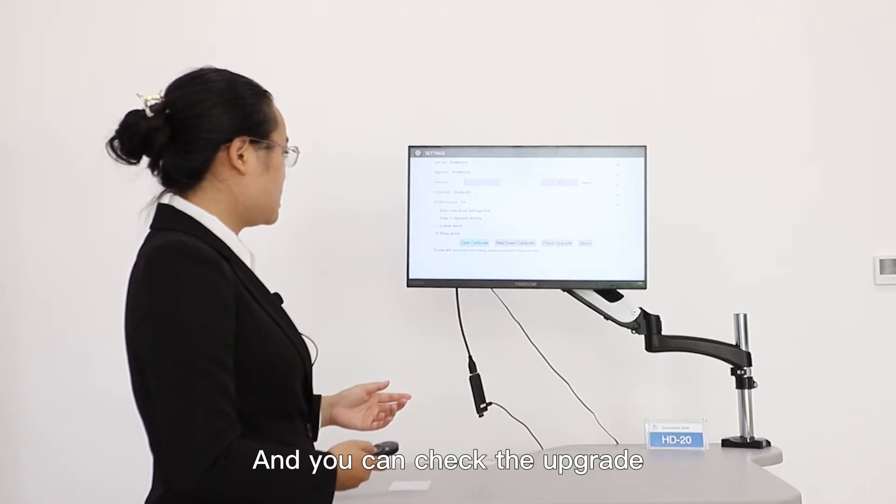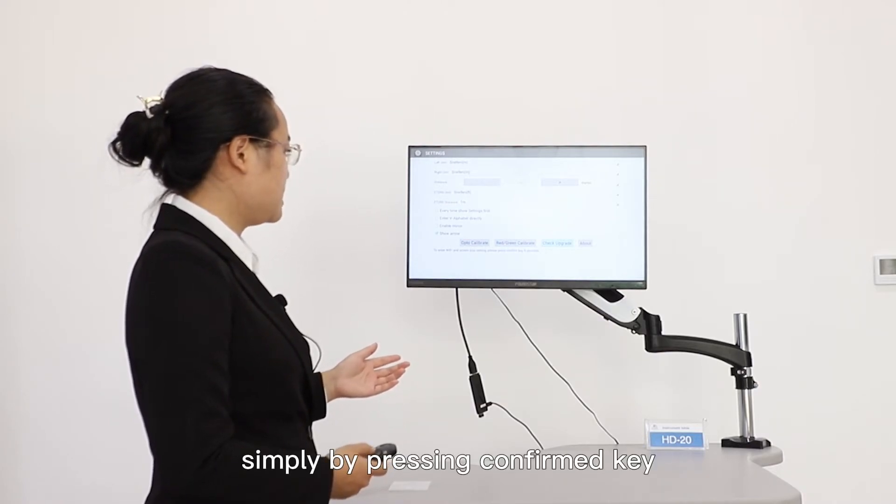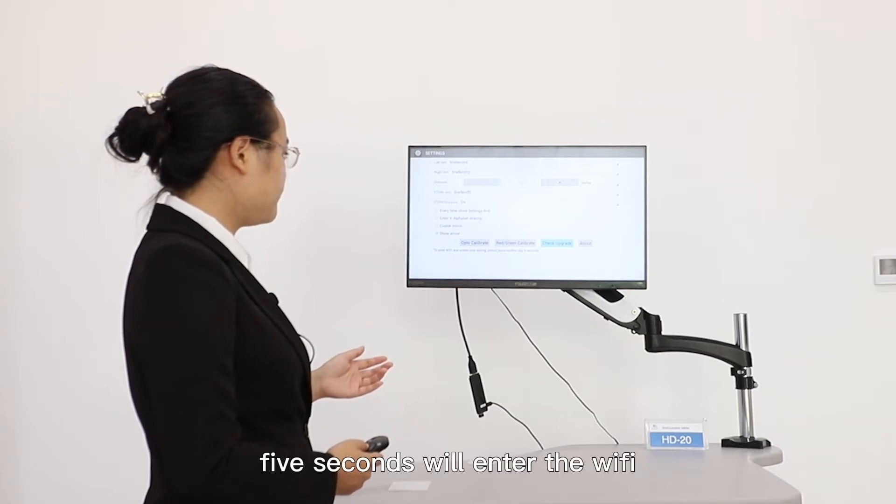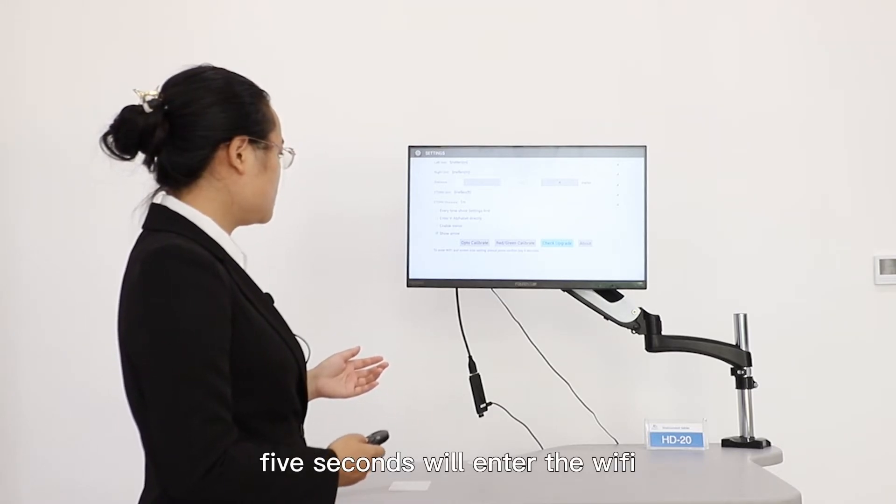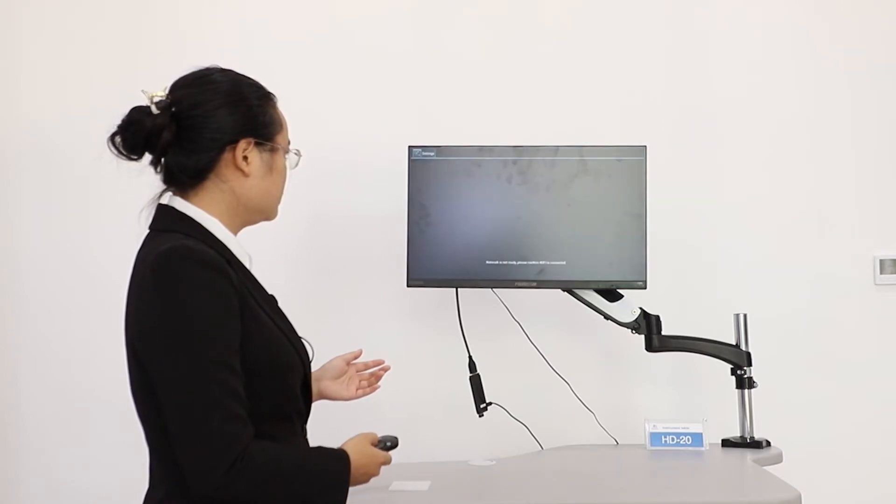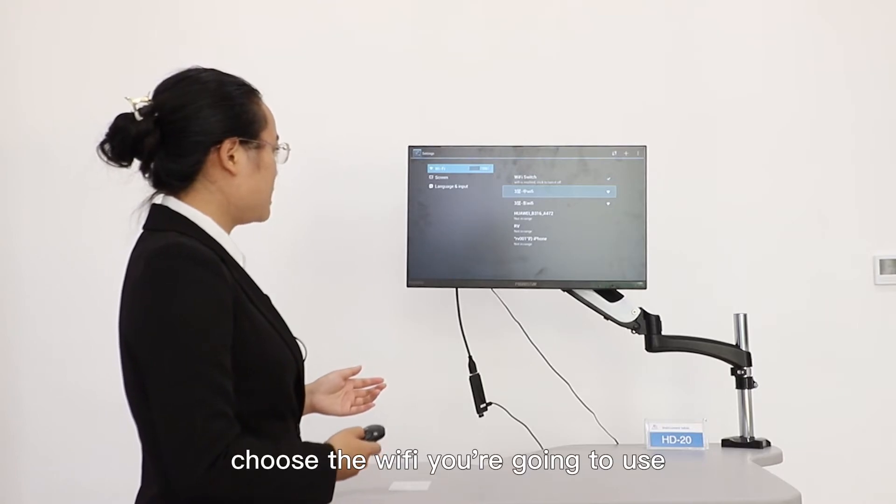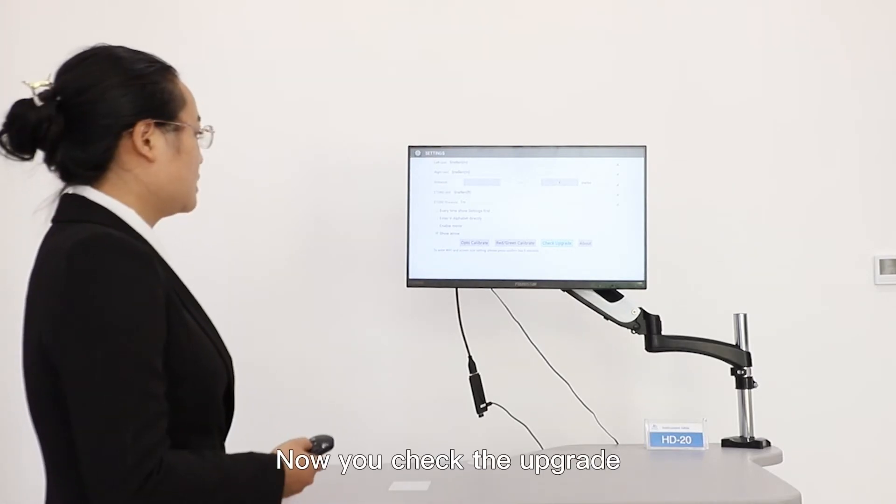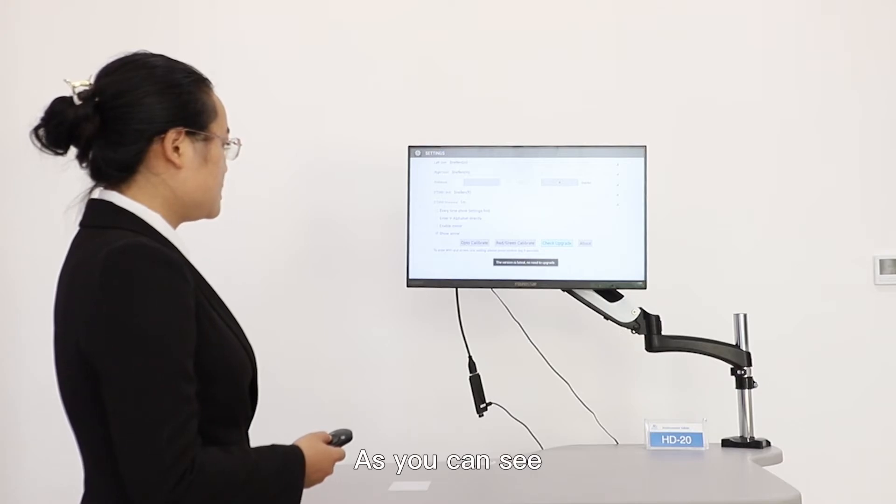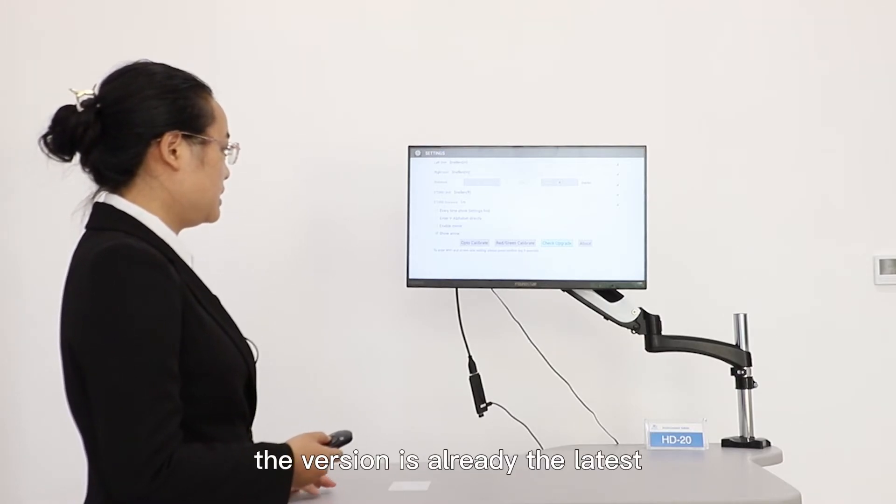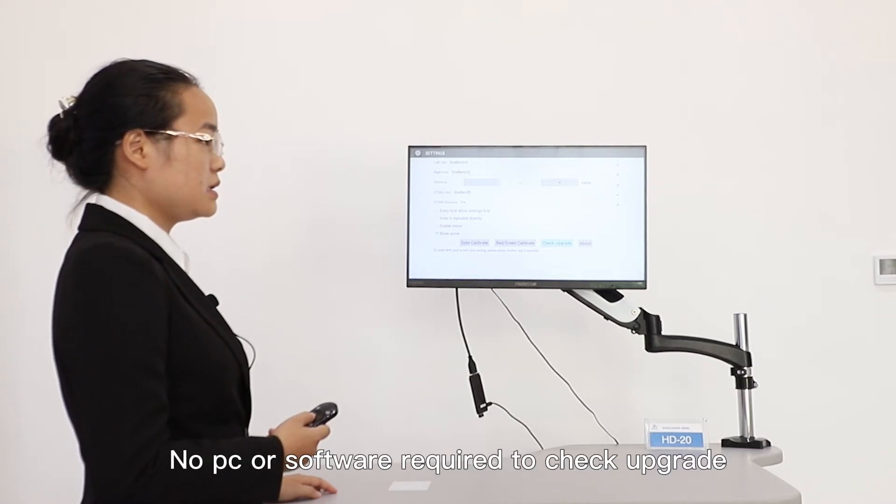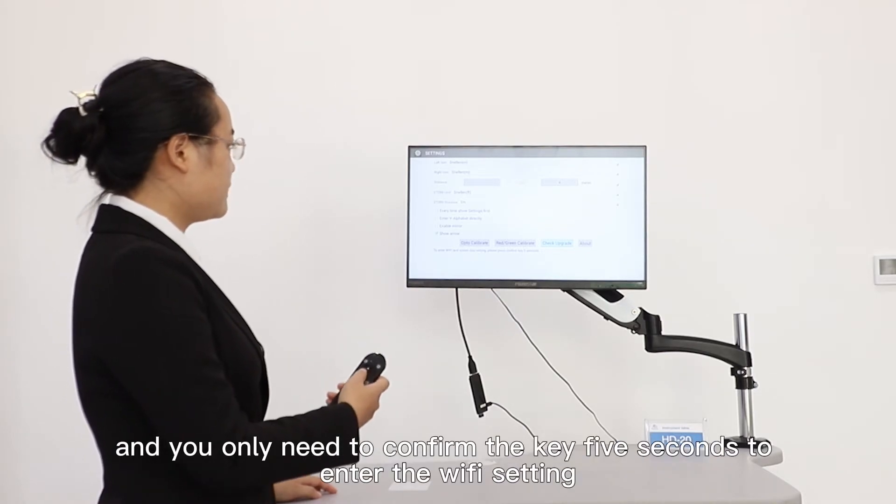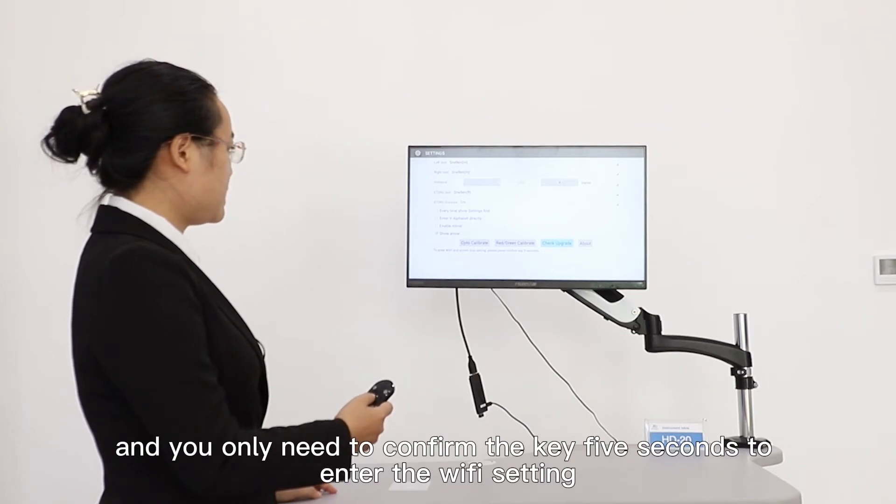And you can check the upgrade simply by holding the confirm key. Press the confirm key for 5 seconds. We will enter the WiFi. Choose the WiFi you are going to use. Then go back. Now we will check the upgrade. As you can see, the version is already the latest. Very simple. No PC or software required to check the upgrade. And you only need to hold the confirm key for 5 seconds to enter the WiFi setting.